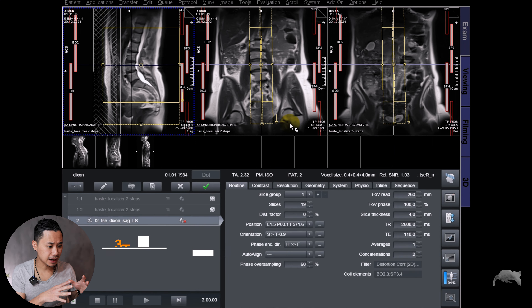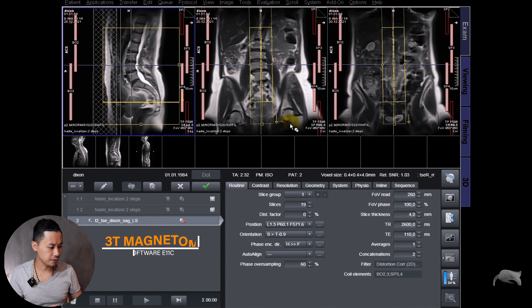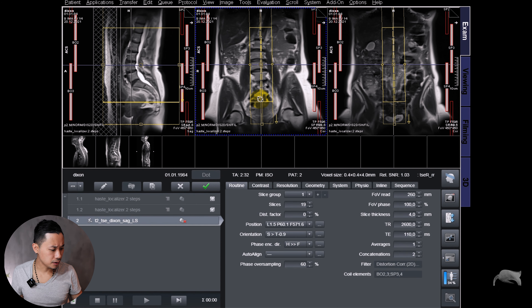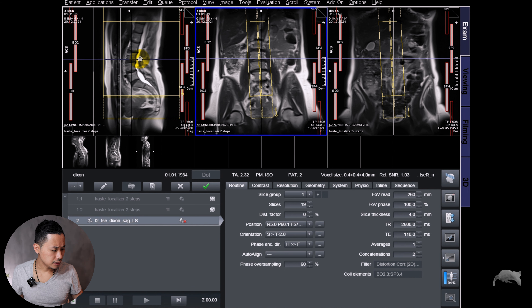A few of you guys have asked me how you can do fat quantification, so I'm going to show you today how you easily can do this by applying a 2D turbo spin echo Dixon — or 3D if you want. Just a few steps and you have the map or the sequence, and this will make your radiologist happy because they can then do a region of interest in PACS and get a fat percentage or water percentage.